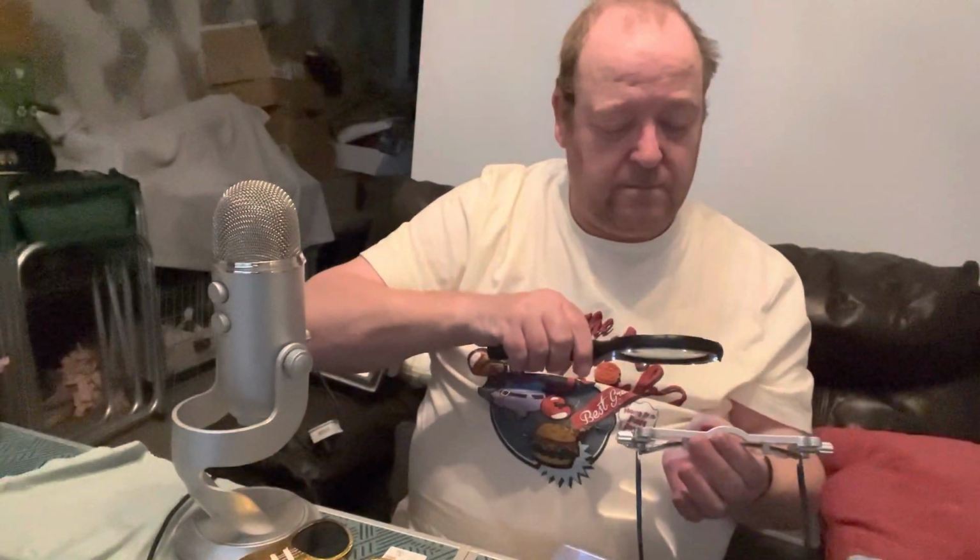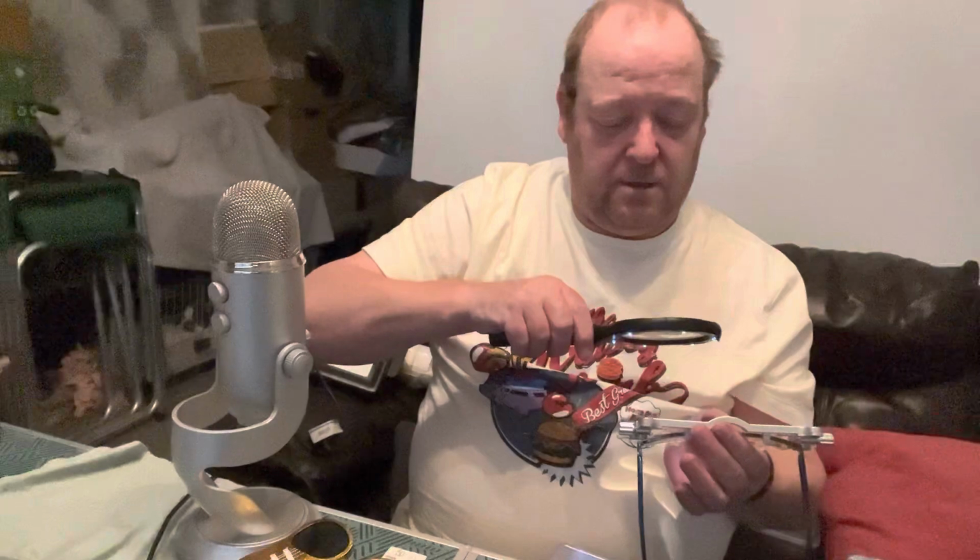If it was for a bifocal, instead of measuring it level with my pupils, I would bring it down so it's level with my bottom lids. And that would now read 15 heights. But that's a simple way of taking the measurements for the heights on multifocal lenses. It's neatly boxed.